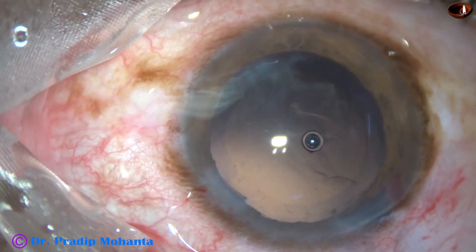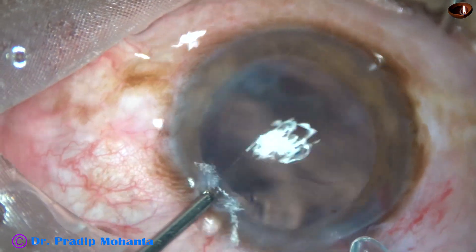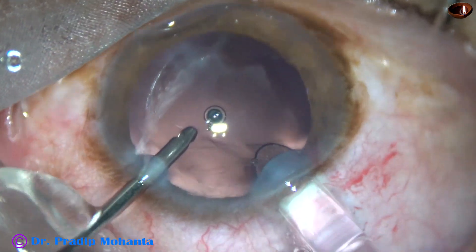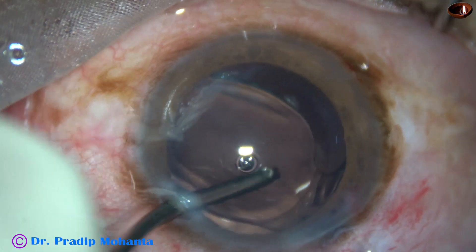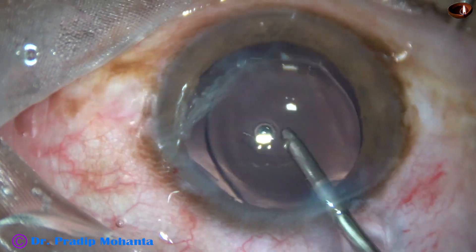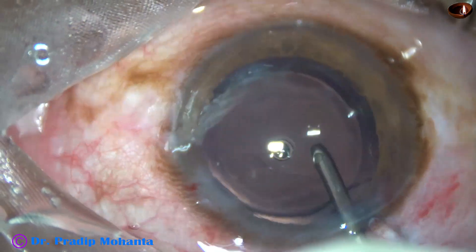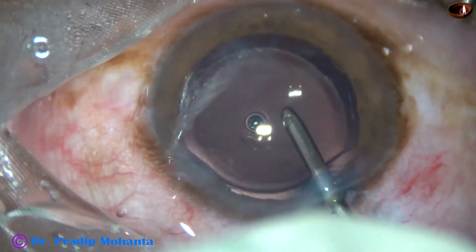Hydro-implantation of a single-piece monofocal intraocular lens is done. Both haptics go into the capsular bag. Irrigation is done in the anterior chamber so that any viscoelastic remaining in the lumen of the cartridge is cleared out.